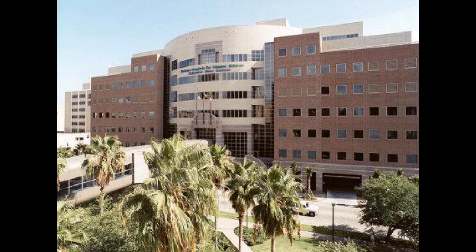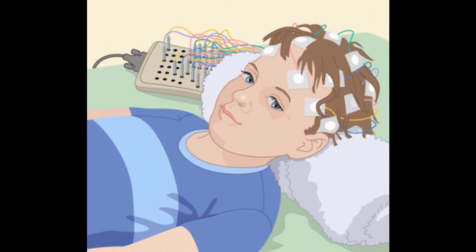Most EEGs can be performed in an hour and can either be performed in an area imaging center or hospital. To perform the test, you will be asked to lie on the bed or sit in a chair. The EEG technician will attach electrodes to different locations of the scalp using adhesive paste. Each electrode is connected to an amplifier and EEG recording machine.